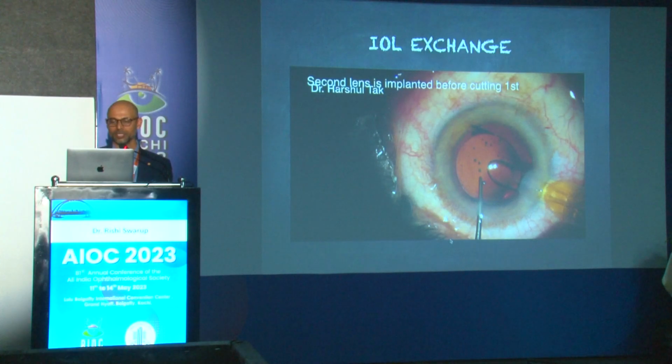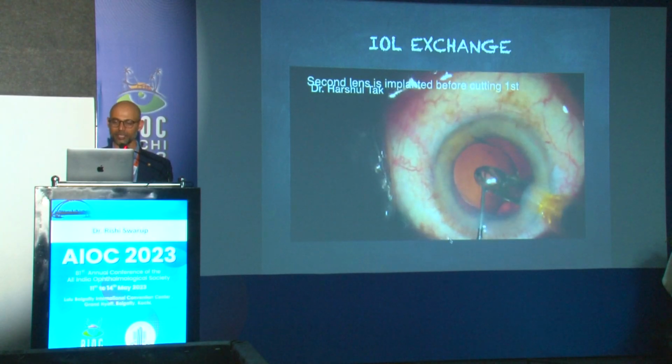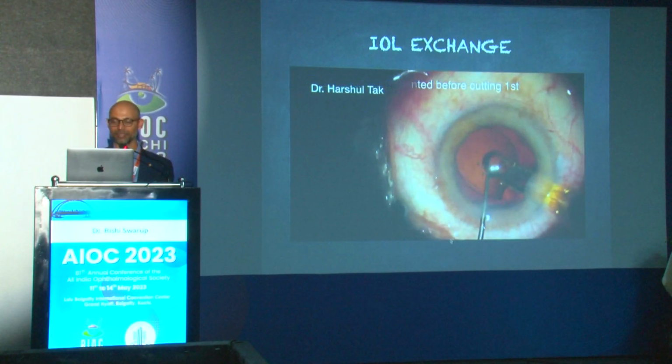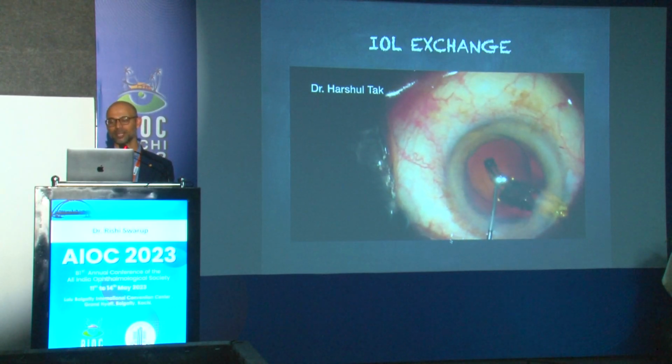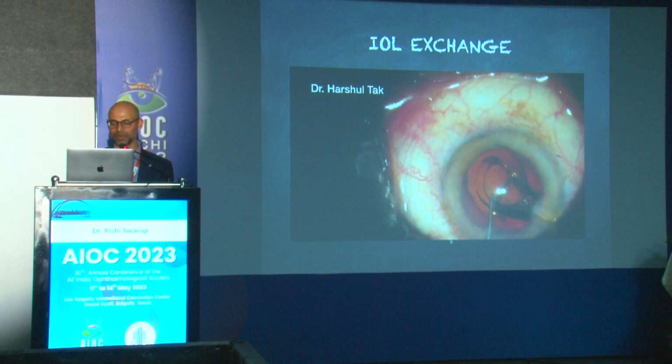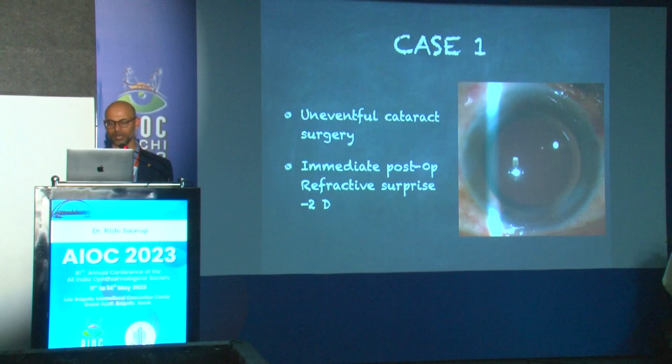Okay, so IOL exchange is another option. This is a video I borrowed from Dr. Harshul Tak, my friend. So I think it's a good idea to put in the second lens first and then cut and remove the other lens, so it makes the IOL removal a little safer and you don't end up damaging the bag. That's what he's demonstrating here. And of course, then you put the lens at the appropriate axis. So I'll just show 2 cases and I'll close.